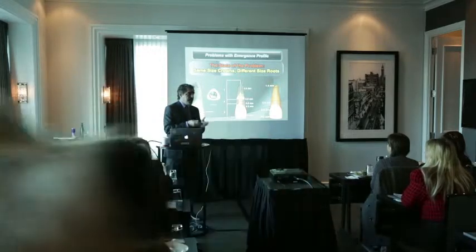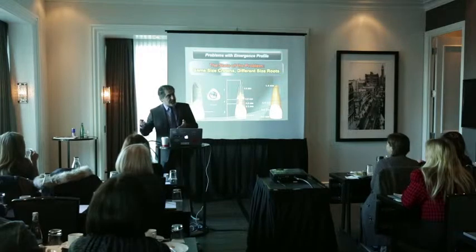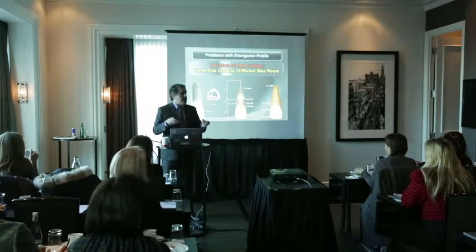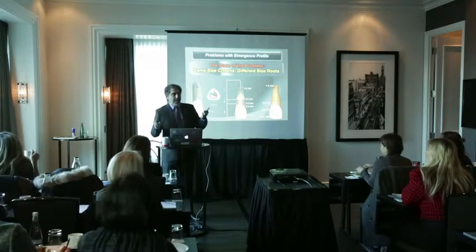And if we place a larger implant to have a prosthetically driven prosthesis, we are going to be risking losing bone around our implant, because then the amount of bone around our implant is going to be very limited. So it's like a balance.